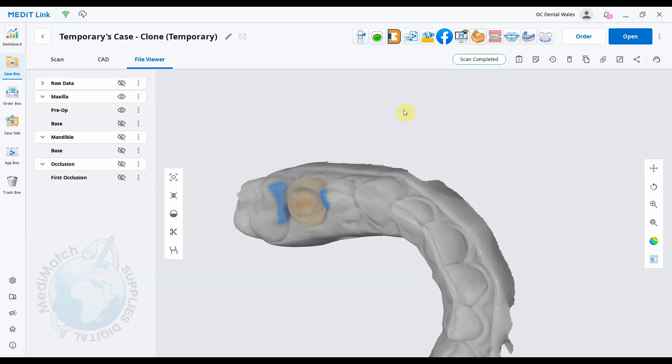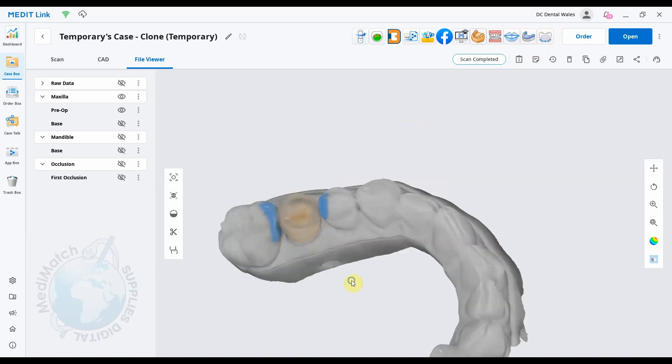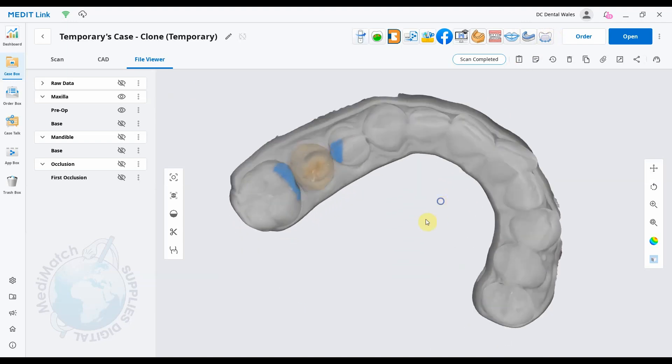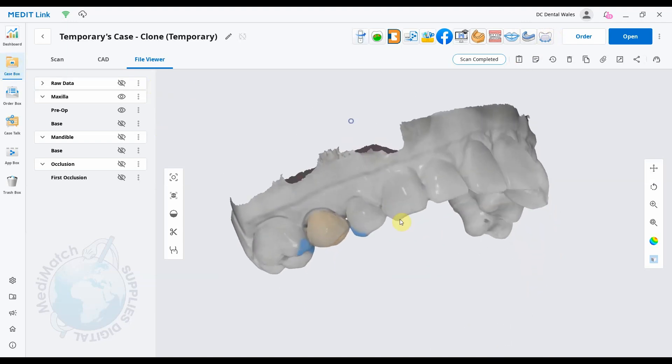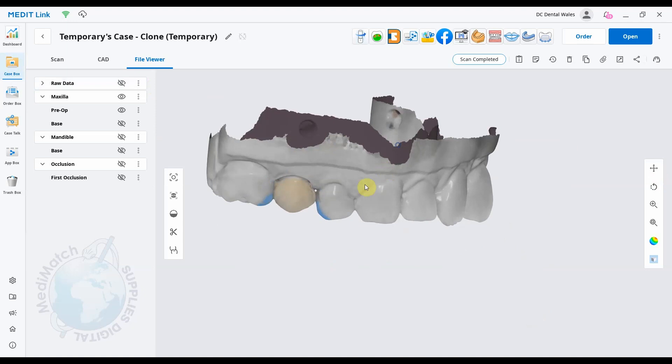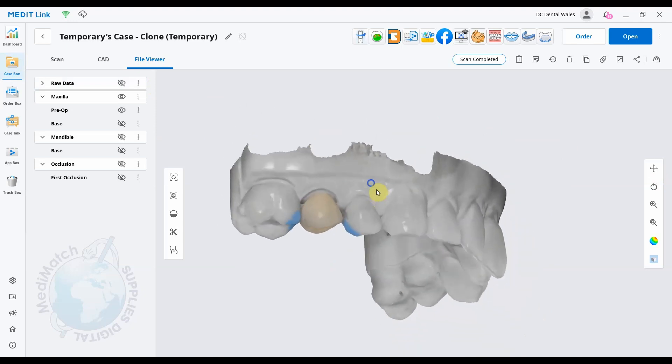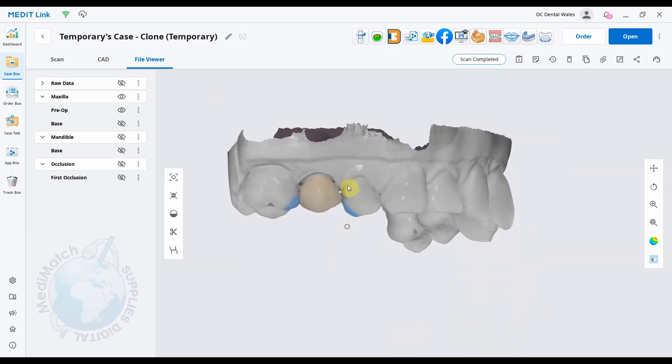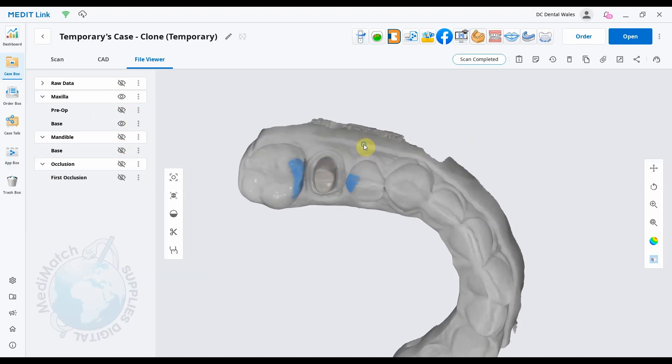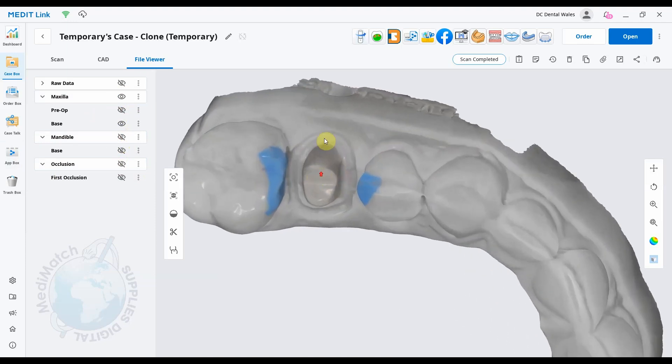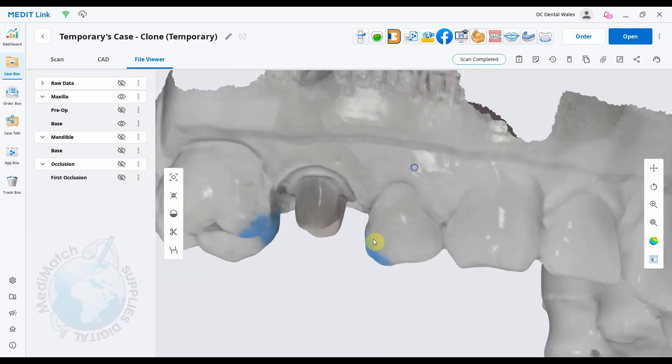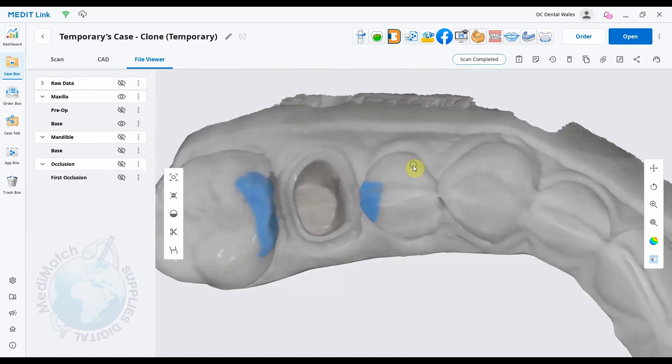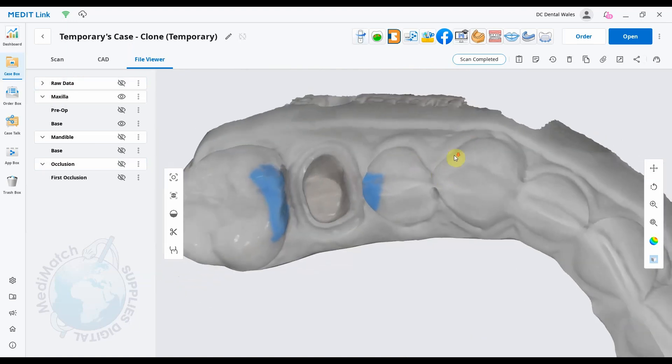Hey everyone, it's Dave from Medimatch. Hope you're doing well. In this video, we're going to take a quick look at the latest update of the temporaries app from Medit. So what we've got here is a case that in the pre-op stage I've put a crown on the model and scanned it. You can see that's the pre-op there. If I turn the pre-op off, I've also got the base scan as well, so I've got both the pre-op and the prepared tooth on different stages.